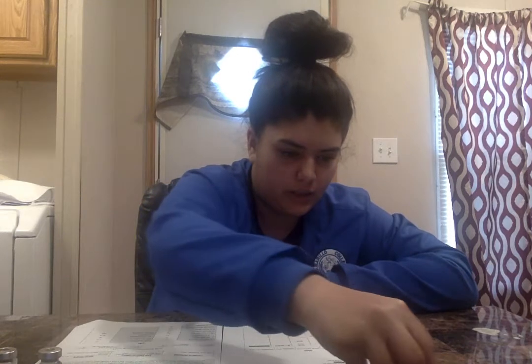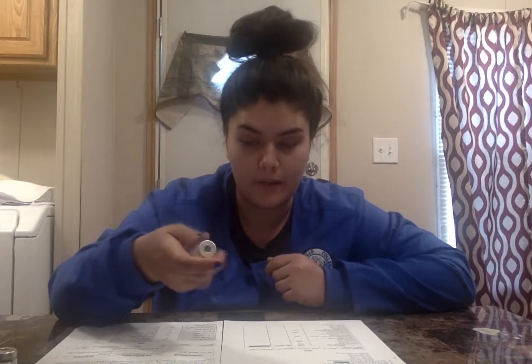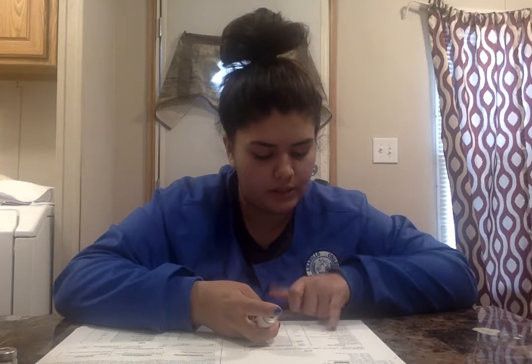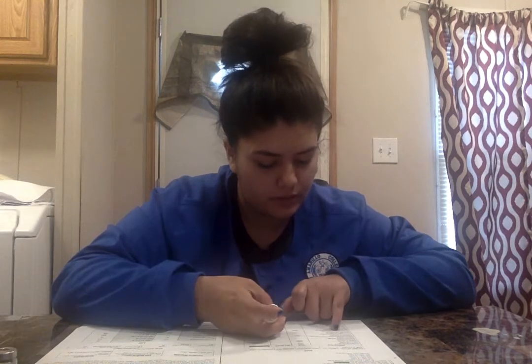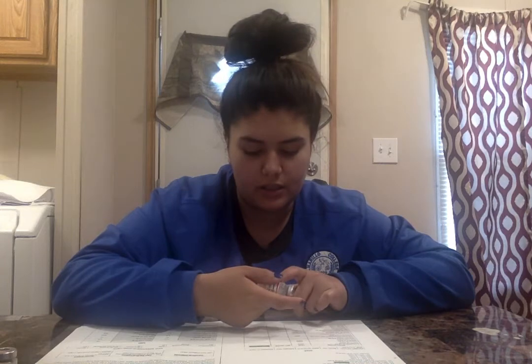Next, we'll be doing our NPH. Even though this isn't due until 2100, we're going to go ahead and put it in the med card. So insulin, NPH, 25 units subcutaneously, available 100 units per milliliter. We're supposed to give 25 units subcutaneously every PM. And this expires 02 of 2028. So this is the right medication that we're supposed to give at 2100.